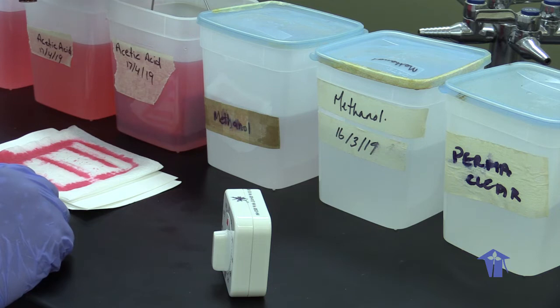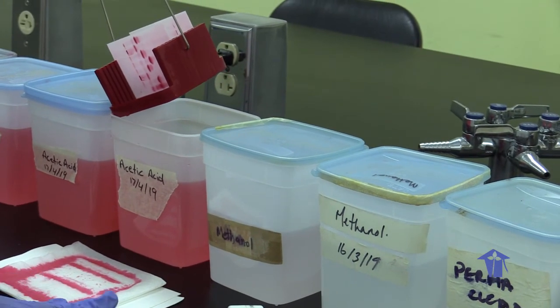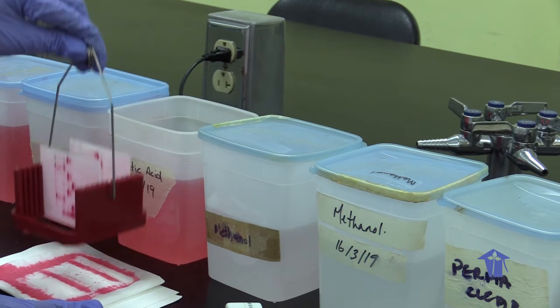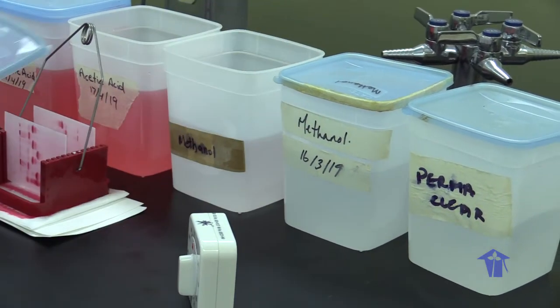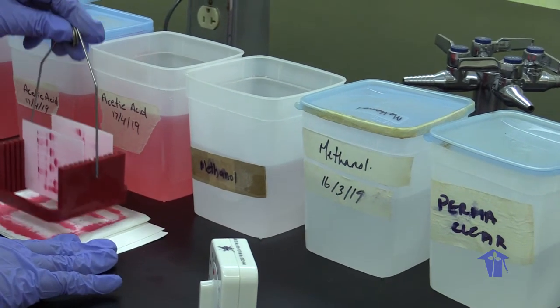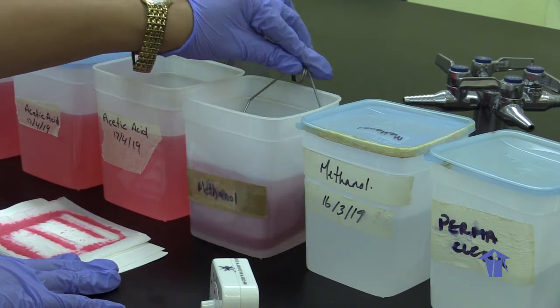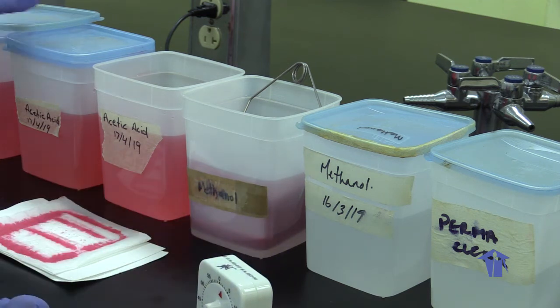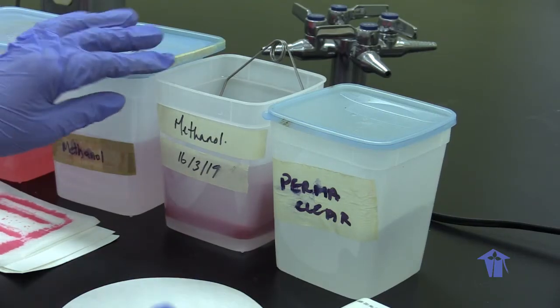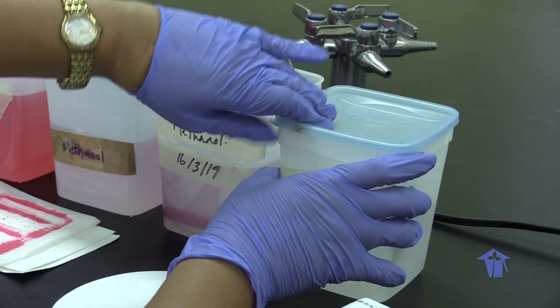So after the 3rd acetic acid, place it in methanol to dehydrate the slide. 2 minutes again. 2 methanol. So after the second methanol, we're going to put it in Permaclear for 3 minutes.